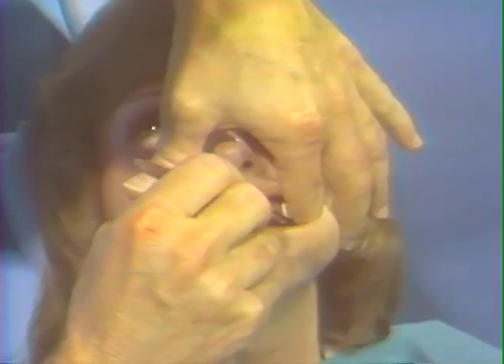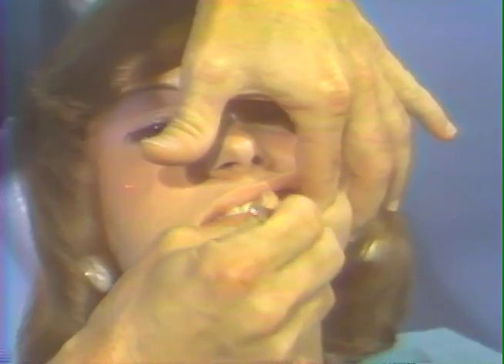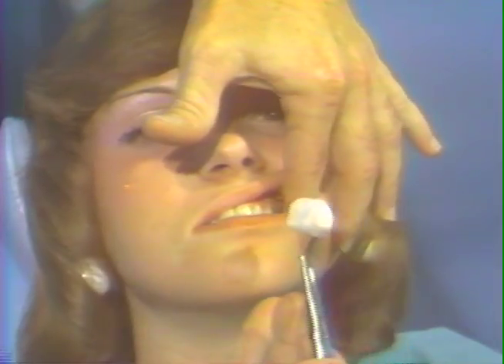One to 2 minutes should be allowed for mucous membrane contact. Burnishing the mucosa with cotton roll prior to removal can aid in penetration of topical anesthetic agent, and thus better topical analgesia. The removal of the cotton roll should therefore be done in this manner. Betty, now open your mouth once again. Let me pull your cheek to the side. I'm now going to rub this onto your gum a little bit. That's fine. Now I'll remove this, and now you may close your mouth. The area is now properly prepared for needle penetration.